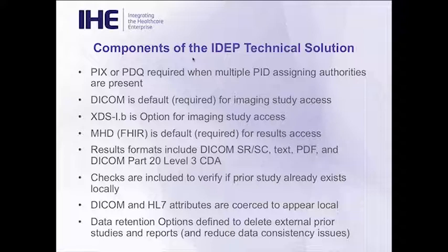We've determined that DICOM is going to be the default or the required method, the baseline method for accessing imaging studies, that XDS-I will be an option for accessing imaging studies, that the ITI profile Mobile Health Documents, which is a FHIR-based profile, will be the default or required for results access, for the reports access.